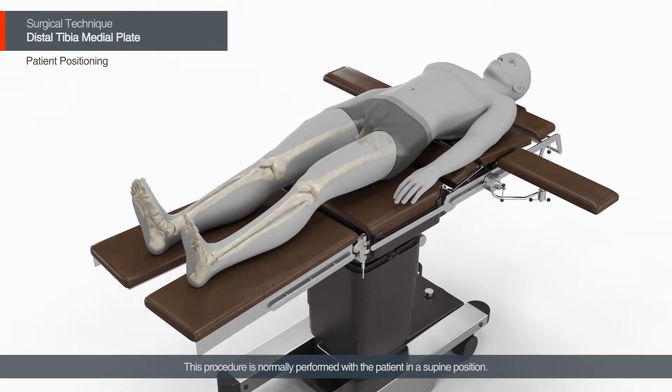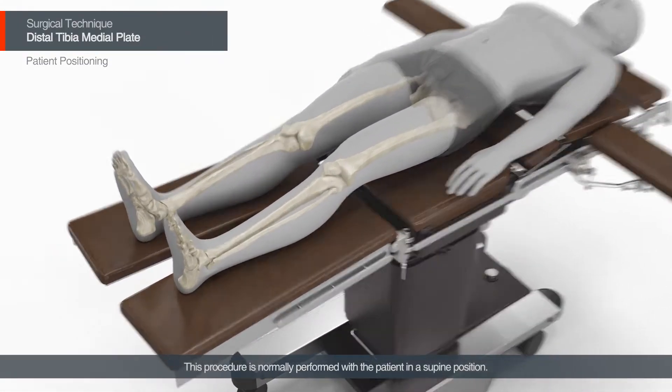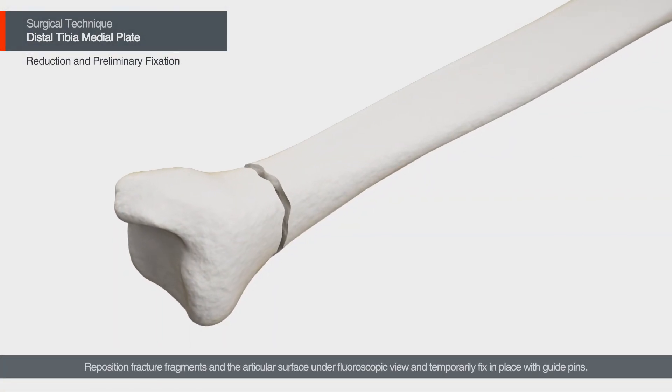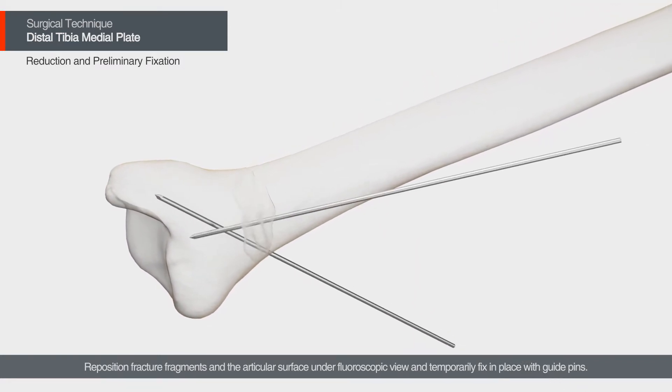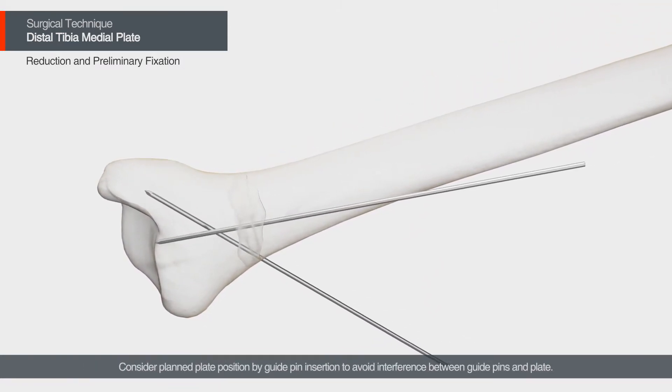This procedure is normally performed with the patient in a supine position. Reposition fracture fragments and the articular surface under fluoroscopic view and temporarily fix in place with guide pins. Consider planned plate position by guide pin insertion to avoid interference between guide pins and plate.